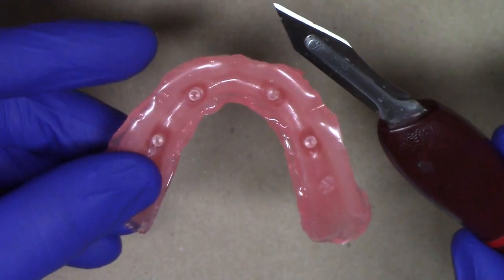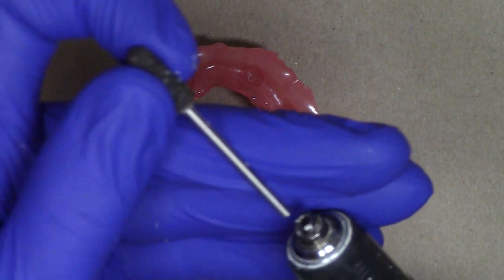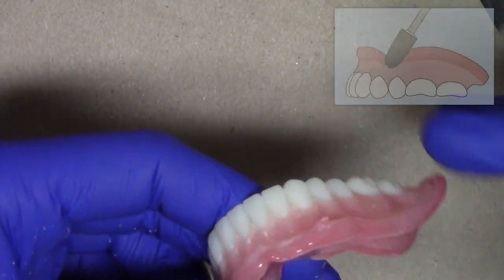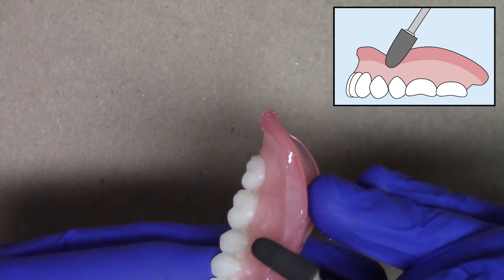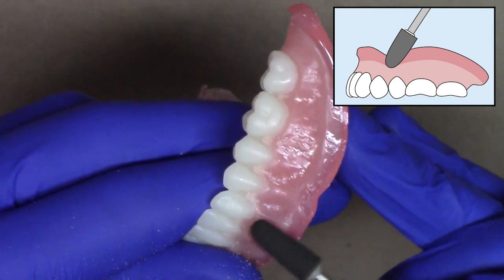Once you've sufficiently trimmed everything up with our 25 blade or any sort of scalpel blade, either a 15 or 12 blade, we can go ahead and remove any sort of burr that we have on our handpiece and put on our coarse point. The coarse point is included in the kit, and you just take this at more of a medium speed and just rub the edges of the CHAIRSIDE Soft Liner.